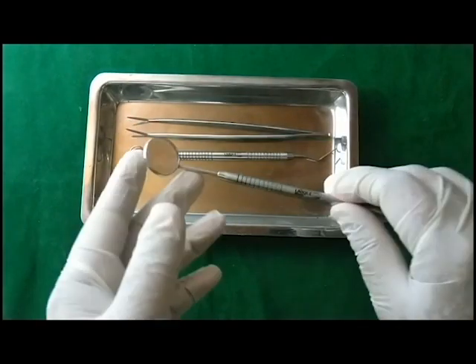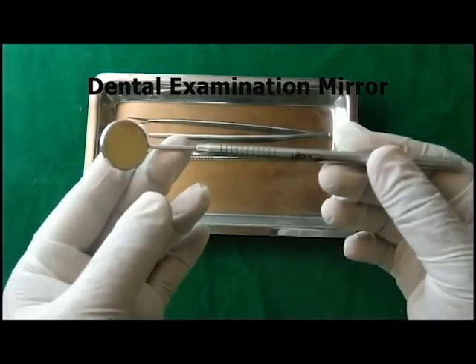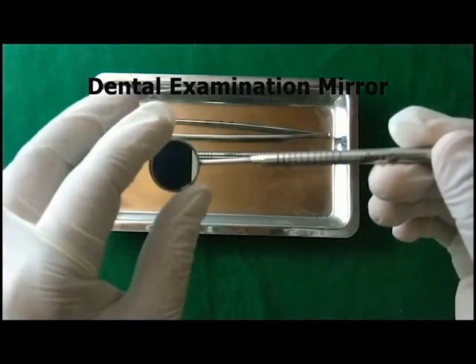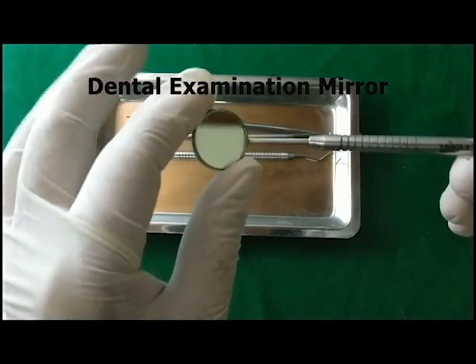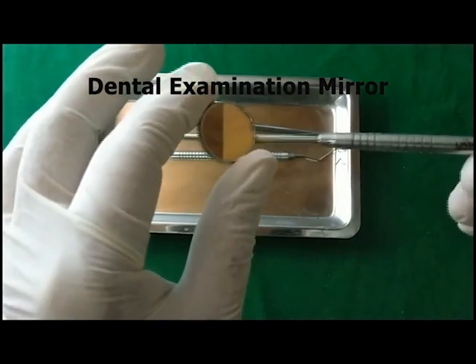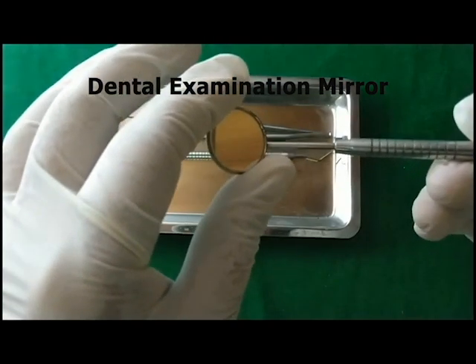The mouth mirror is one of the most important tools in the dental examination set. The mouth mirrors are available in different sizes: small, medium, and large — this one is the medium one. These mouth mirrors are also available in different shapes, for example a round one, and they are available in D shape, U shape, and others.